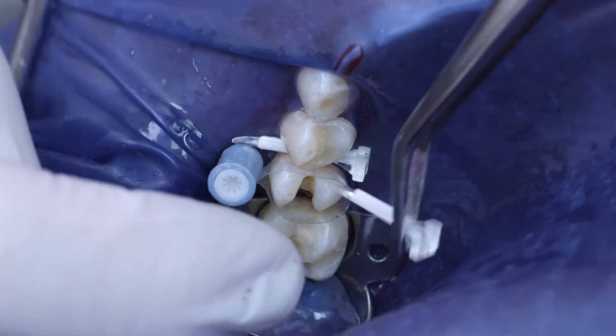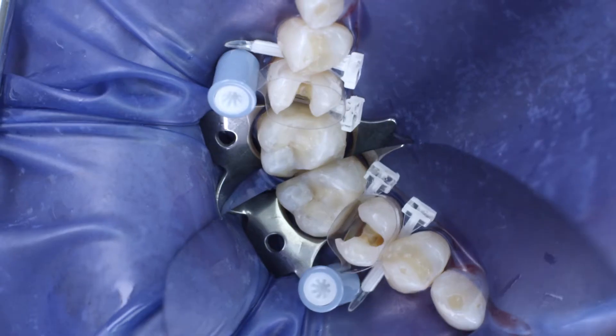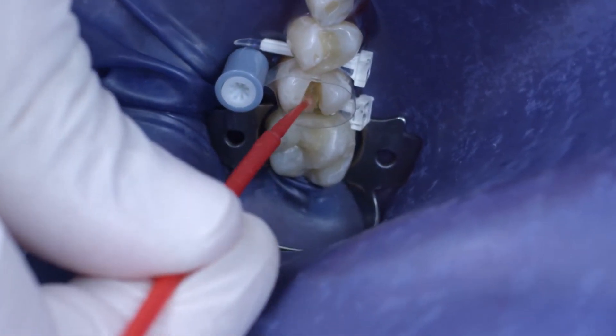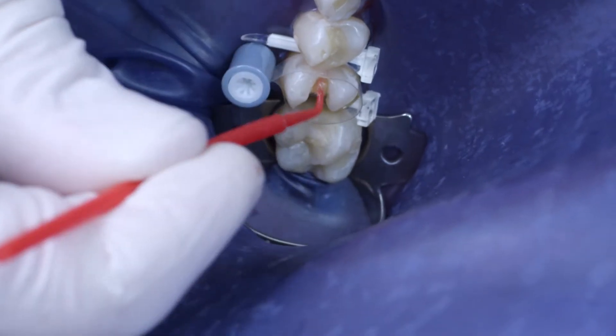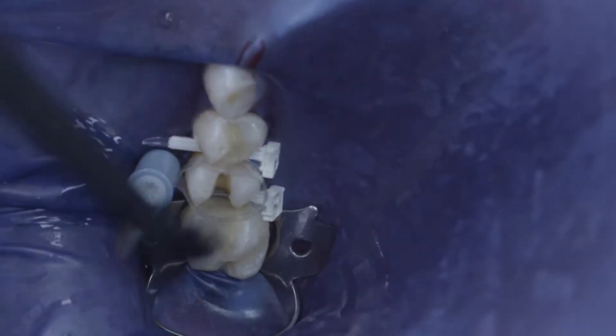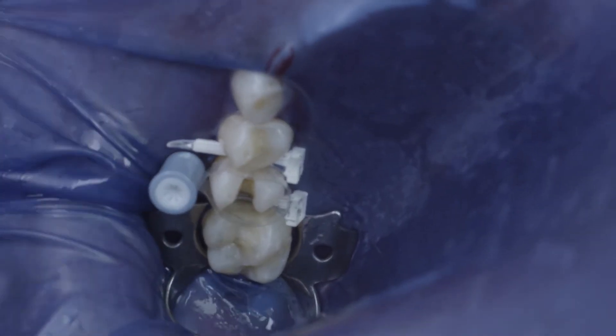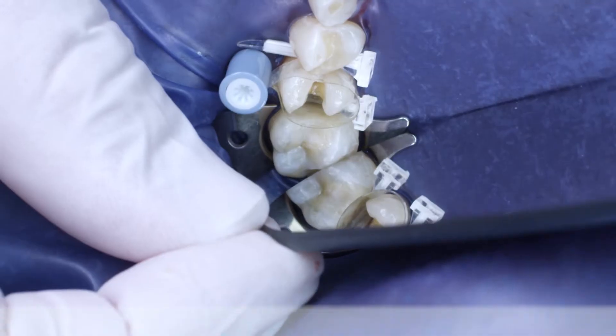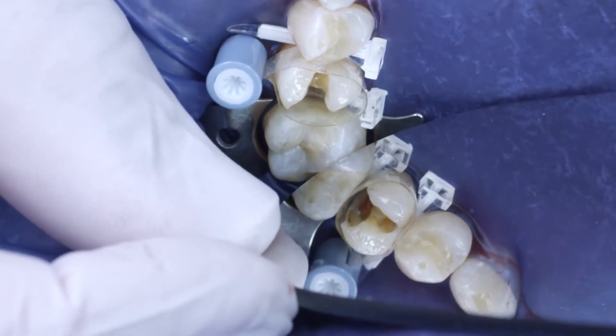Once a transparent matrix band was inserted and secured using wedges, I Bond Self-Etch was placed in the cavity and rubbed in for 20 seconds. Air was then blown onto the adhesive with increasing intensity. I ensured that no areas of excess material were left and that the bonding surface was shining glossy.